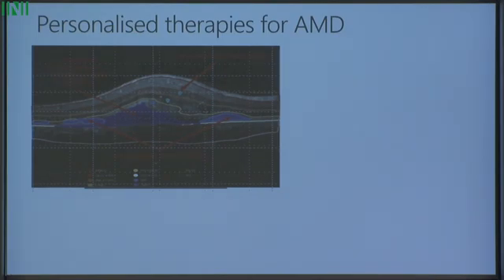We've also been exploring applications beyond cancer treatment and segmentation. So here's an example of one such application. Wet AMD, or age-related macular degeneration, is a disease that affects almost 20 million people worldwide and is the leading cause of irreversible vision loss. So here's an OCT, or an optical coherence tomography scan. This is an eye scan, and what this image is trying to say is that there's been a lot of leakage from the blood vessels, which blocks the vision for the patient.